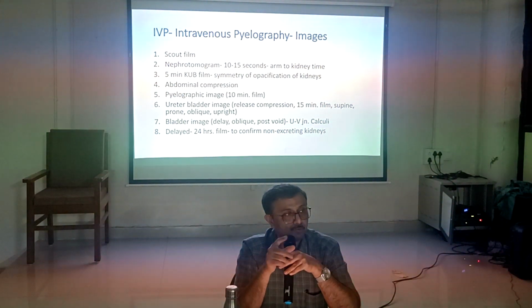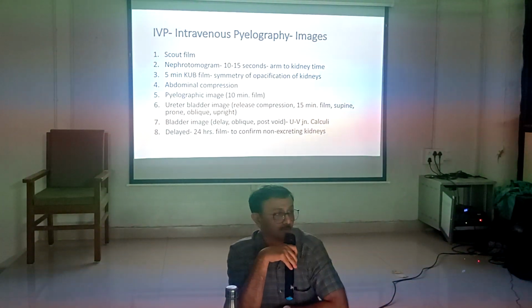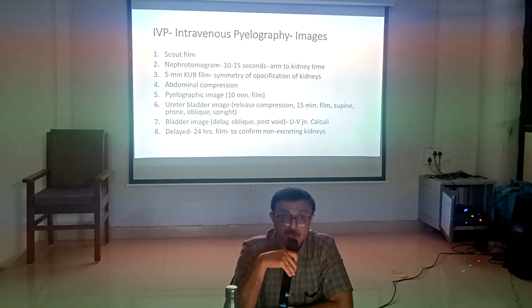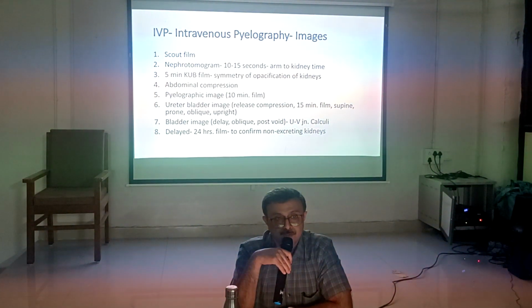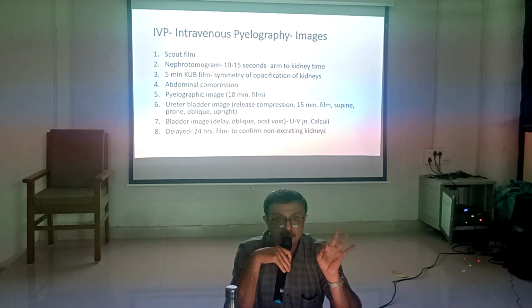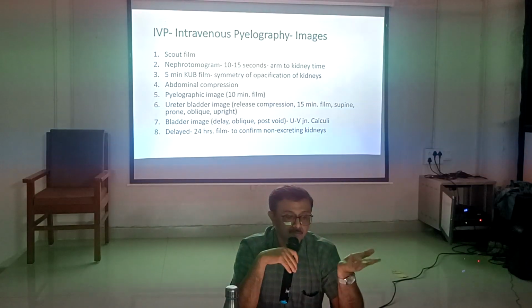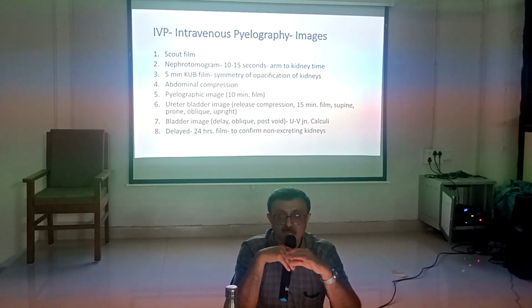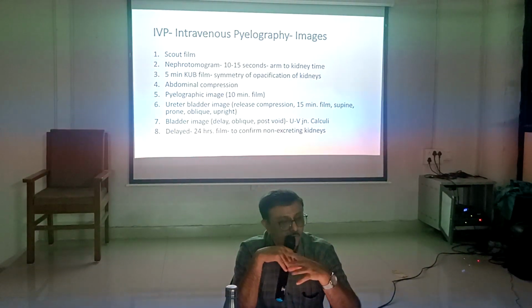It may be IVP or another urography, because we have to rule out urinary tract anomalies and assess kidney function. Is the kidney excreting or not? So function of the kidney can be judged and various anomalies can be identified by prior IVP. So IVP is compulsory before doing any urological procedure, endoscopic or open.